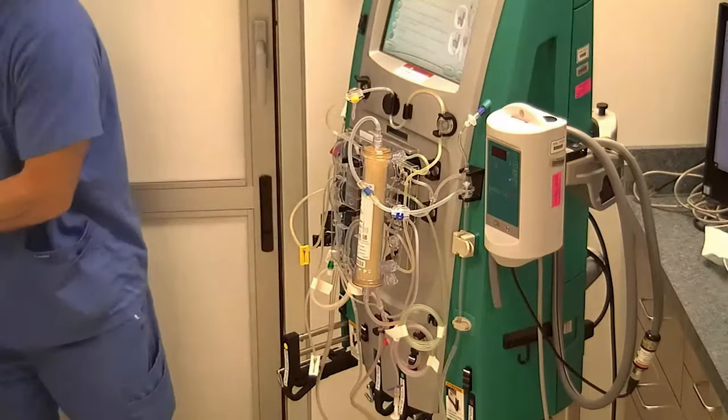So we're going to get it at 100. Then our dialysate flow rate, we're going to take that to 50. Typically, it's much higher though.